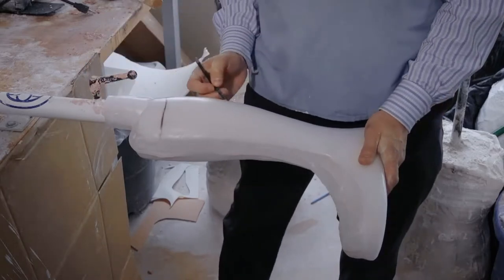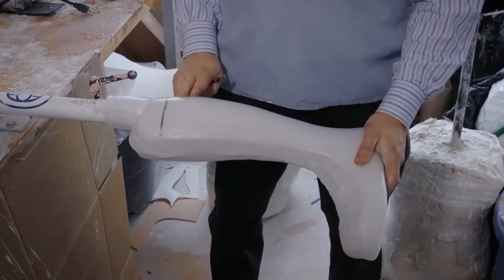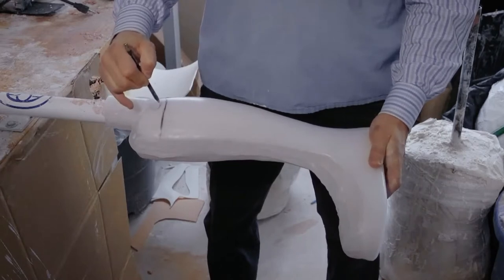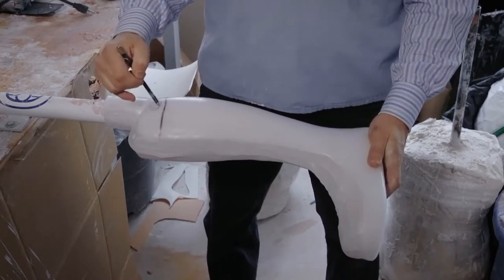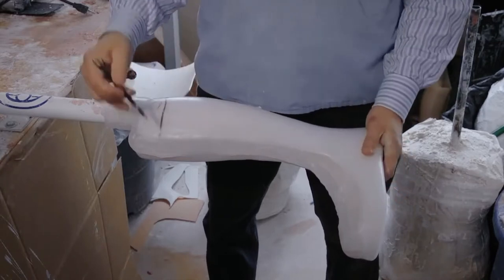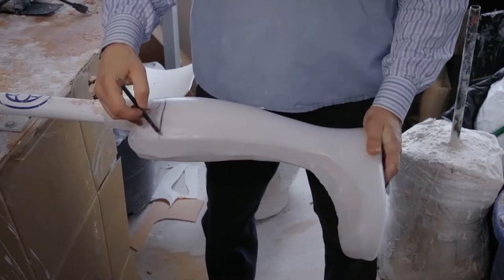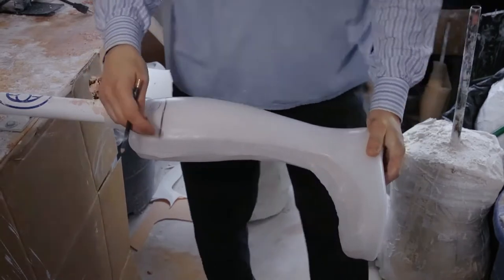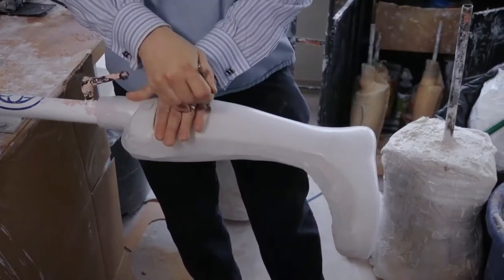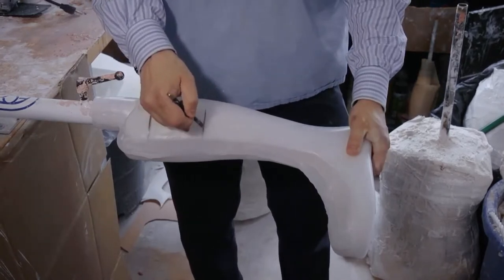Usually, if you see it, it's right around the widest part of the calf, or we'll say the fibular head was right here, something around an inch downward from the fibular head. That's an approximation, but technically speaking, 20 millimeters distal to the neck of the fibular head. So here's our height, and I'm just going to go through the process now. As an orthotist, we're going to draw our lines, you'll see what this turns into in a minute.